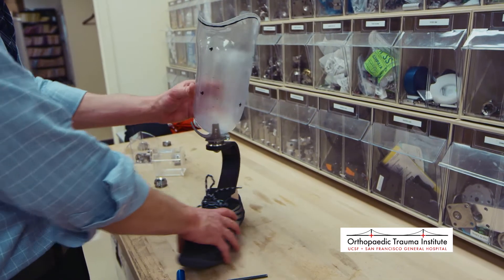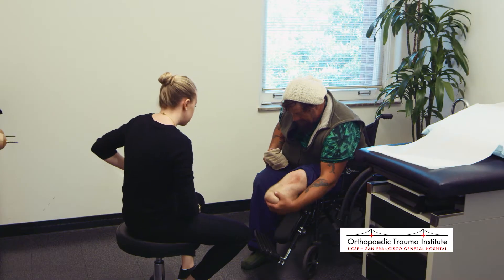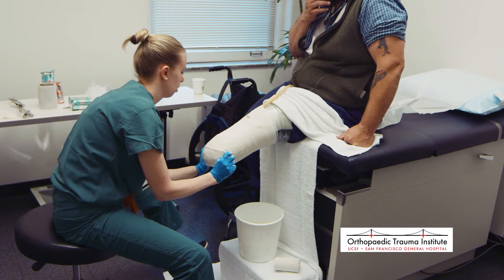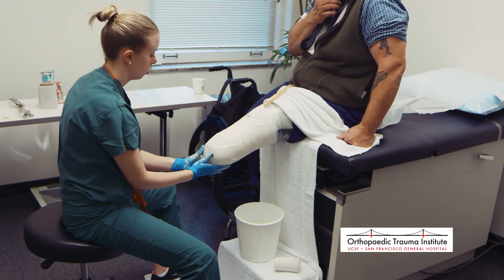Now that we've had a look at how a prosthetic limb is created, let's take a closer look at what the experience is like from the patient's perspective. One of the first steps is casting the patient's residual limb to create the test socket. Here's a closer look at Don's casting, with Hannah describing the items and equipment used in this process.